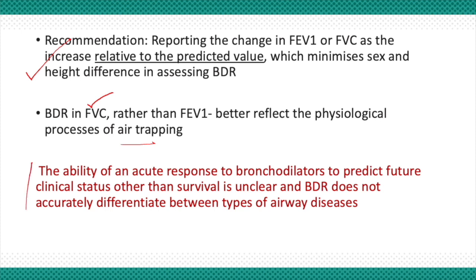Also, very important is to take home the message that the ability of a response to bronchodilator to predict future clinical status is not clear. So we cannot say that this patient, because they are bronchodilator responsive, will perform better. And second, it does not differentiate between types of airway disease. So responsiveness akin to asthma, no responsiveness akin to COPD, this concept has to be changed, and we have to remember that it may not be so. This is really emphasized in this guideline.